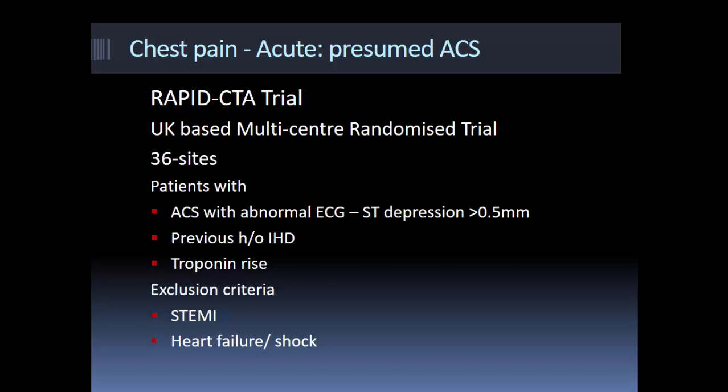So this is ongoing now, and we wait for results probably by next year or the year after, when they complete 2 years of follow-up in these patients. I think they plan to randomize around 2,000 patients to the CTA group and 2,000 to the standard care group.